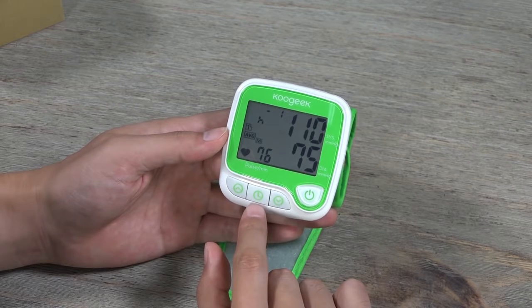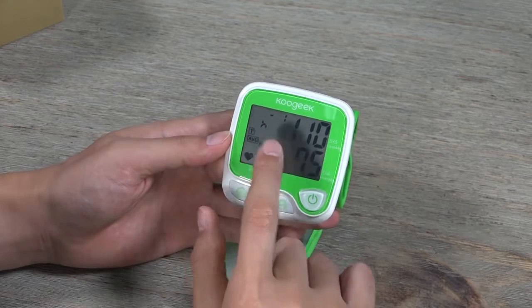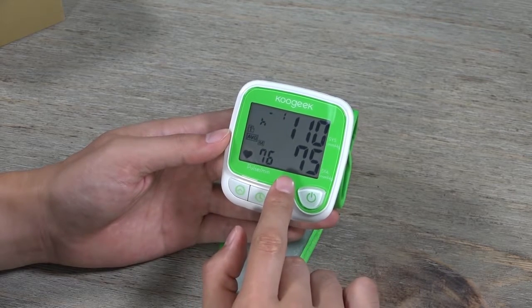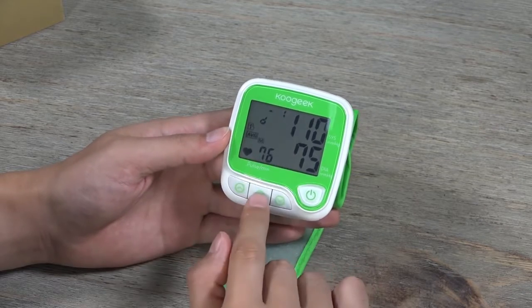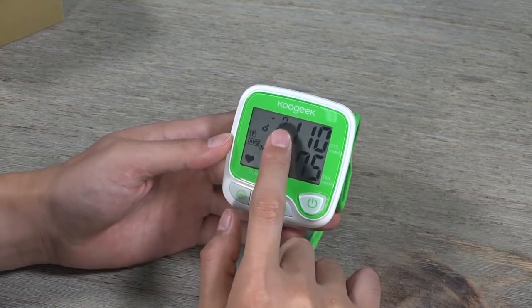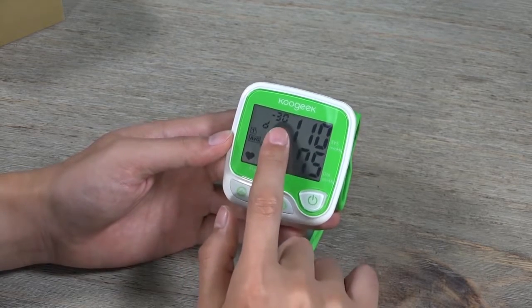The 'H' displayed means hours, so you are seeing the average of your results. You can also view the average of your recent measurements for the past seven days or last month.